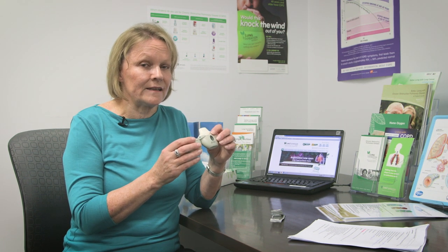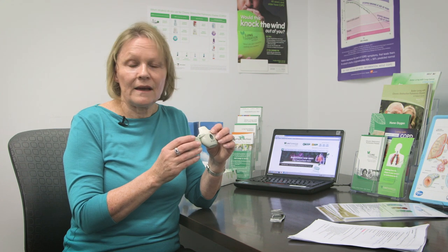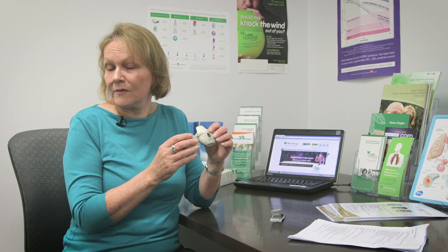Hold your breath for five to ten seconds, or as long as comfortable, and then breathe out again away from the mouthpiece. I'll now demonstrate the device.